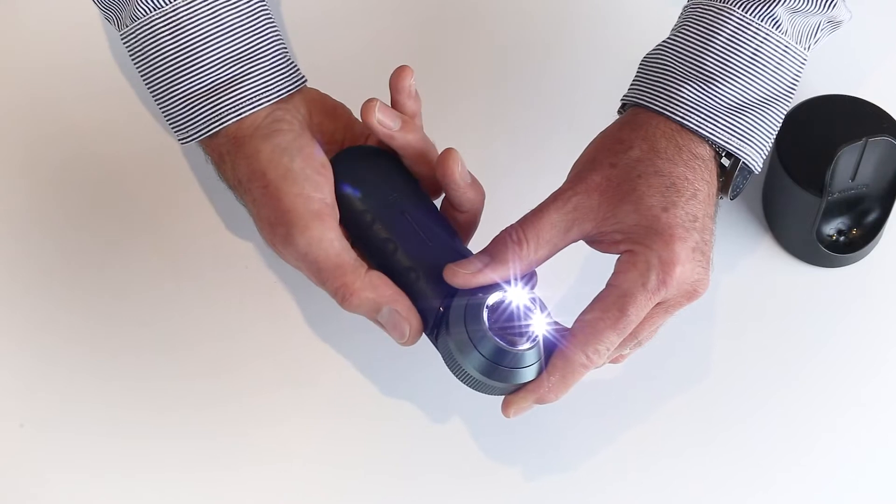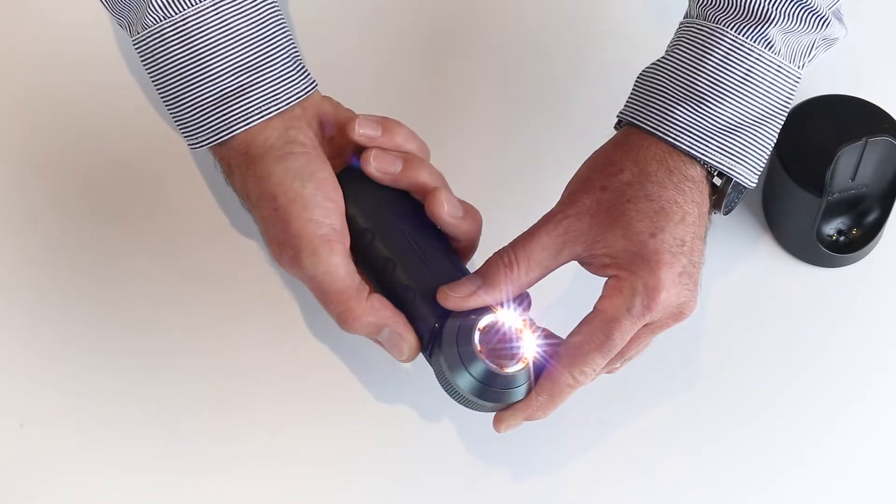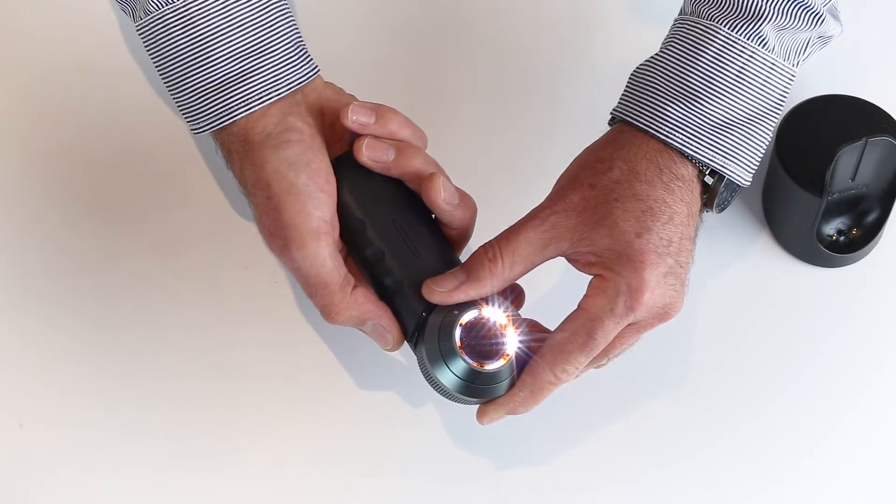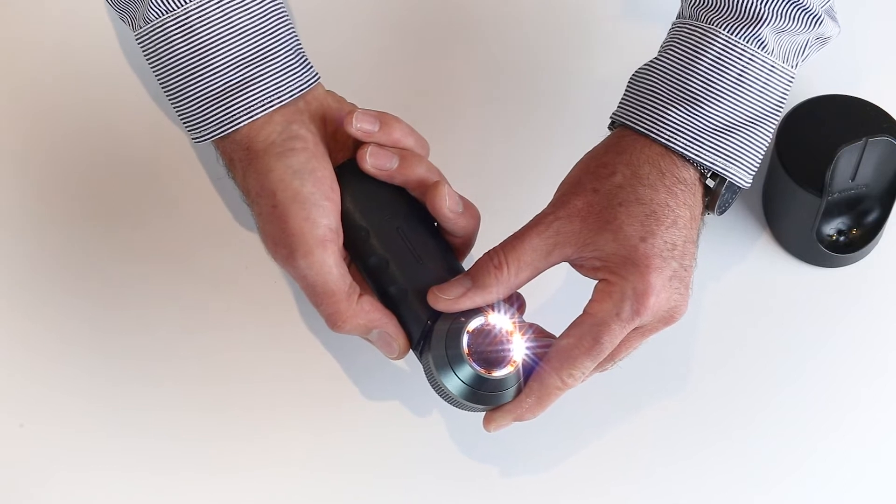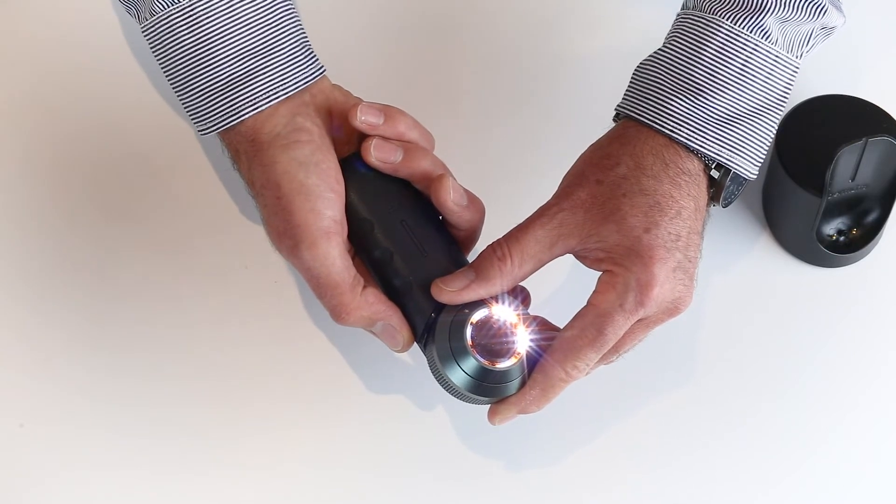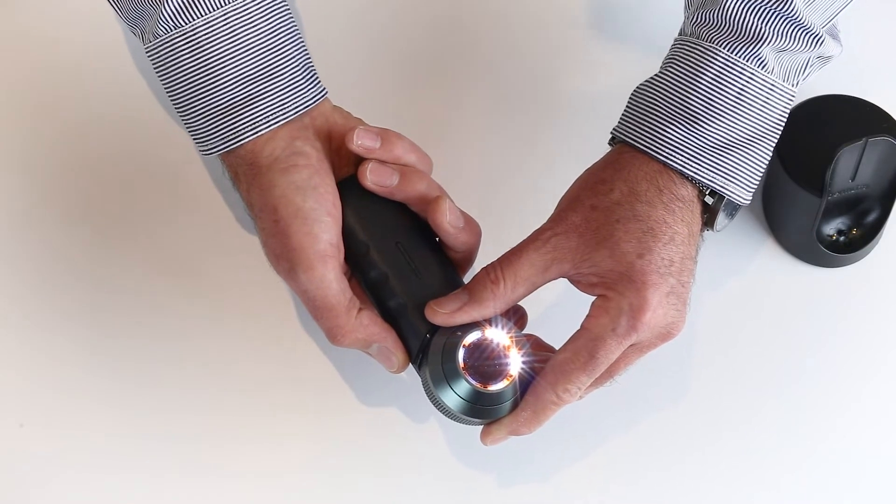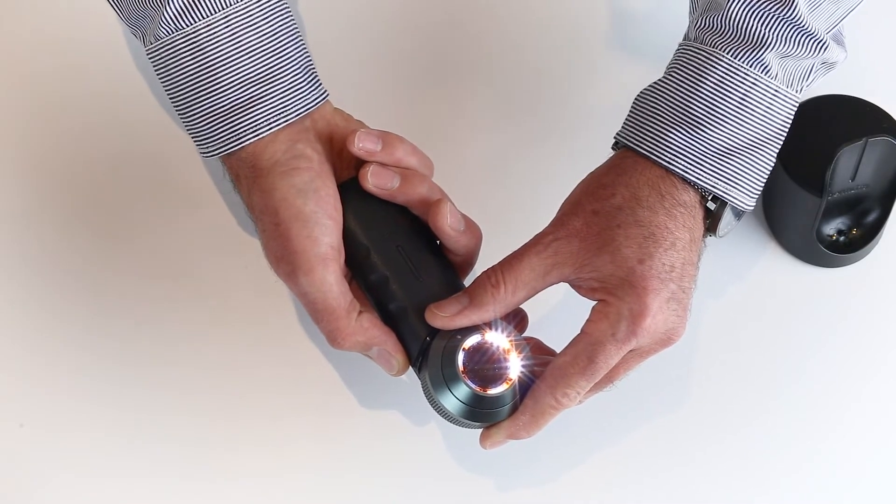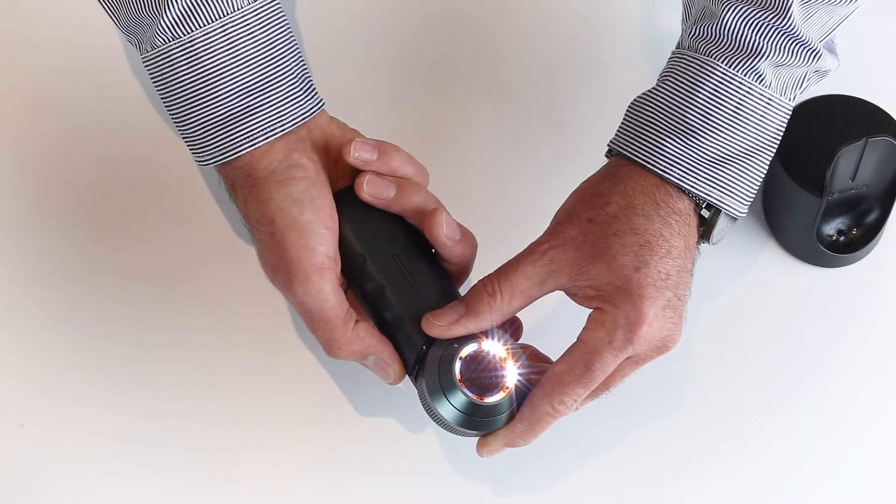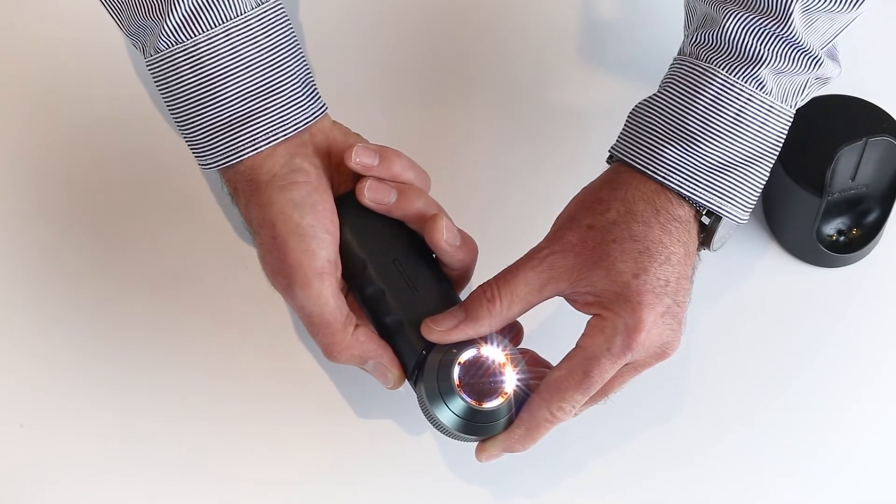On the other side of the handle, where my thumb is, this turns on what we call pigment boost. You can see the orange LEDs. The orange LEDs put a natural skin tone back into the picture that sometimes the white LEDs can wash out. So this gives you a more natural light. This has nothing to do with actual diagnosing—it's really just a personal preference.